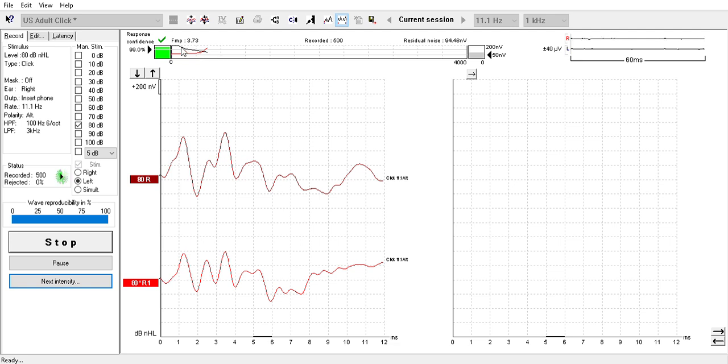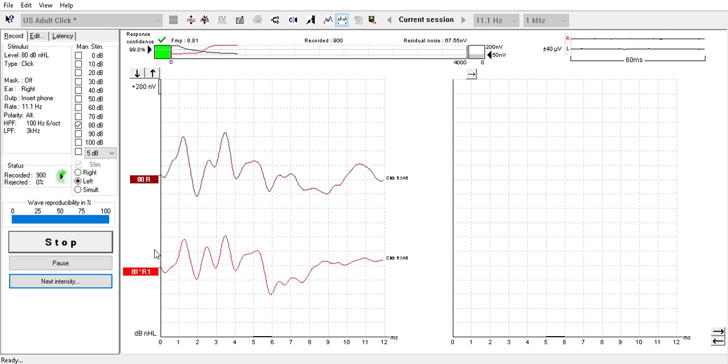As we move across the FMP graph, we see the red line. That's the signal that we care about and that we're measuring. And then this black line is going to be the noise: the patient noise, myogenic noise, electrical noise, anything like that. We obviously want to see these cross over and have a good clear signal, which is the red here, way higher than the noise level. And we're seeing that drop in this particular waveform here, which is really nice. So we're seeing that drop down. We also see that as we were running, this has checked. Our FMP is quite high here, so we're in very good shape. This is a very good waveform, accurate, and it's measuring what it's supposed to measure, and so we would just have to go back in and label those.